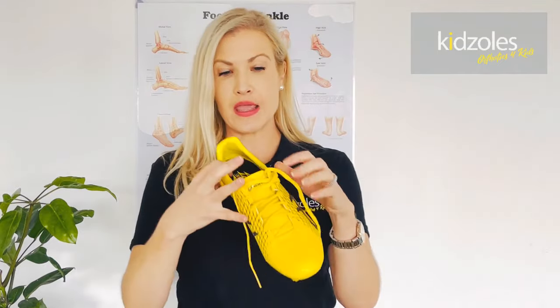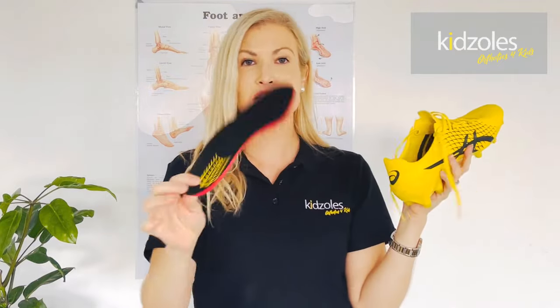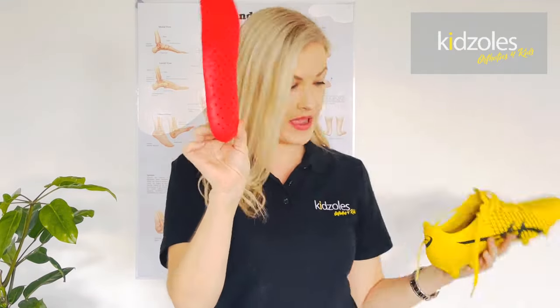I have a football boot here — this is the Asics Menace — and we're just going to pull the insole out. This is going to be our template.